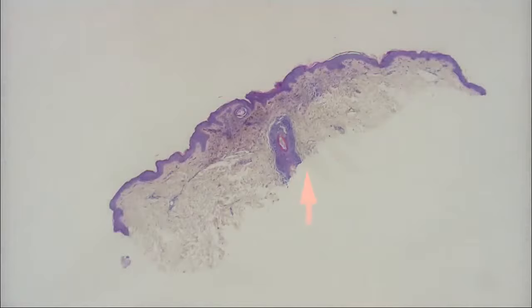How big is this thing? It's not very big. It's pretty small. Teensy tiny. Probably a millimeter, 2 at the most. Very, very small lesion. So when something's small, is it generally benign or malignant? Generally benign. Yeah, usually benign. So I was thinking it's more benign. Yeah, good. I'm glad you were.